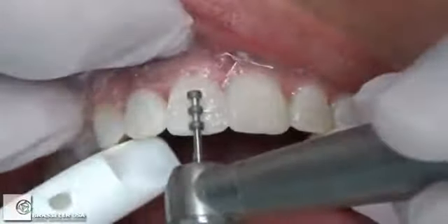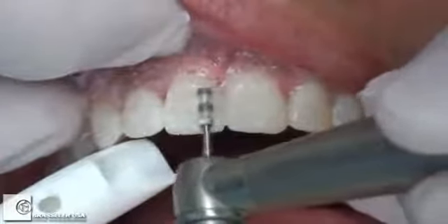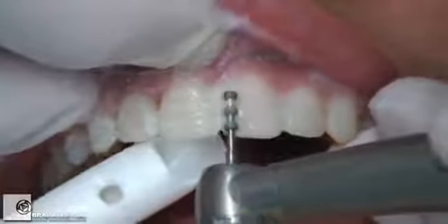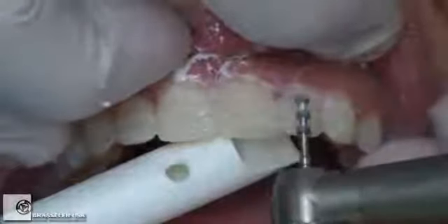And this becomes very simple if we know we're going to end up, if we've done this essentially 3D smile design. I'll get out a depth cutting burr based on the color change. We need about 2 color changes, so we need 2 shades color change, about a 5 to 6/10 of a millimeter thick veneer. So I get out a 5/10 depth cutter from Brasseler.